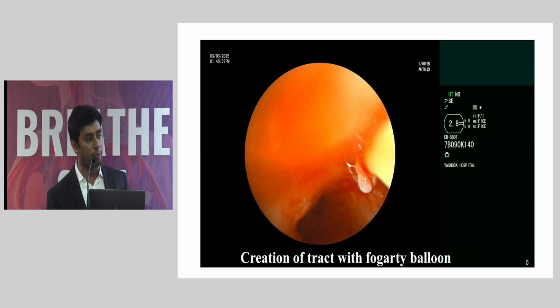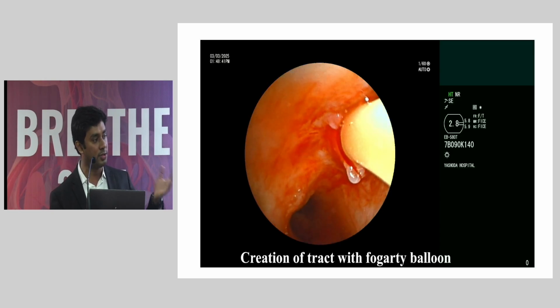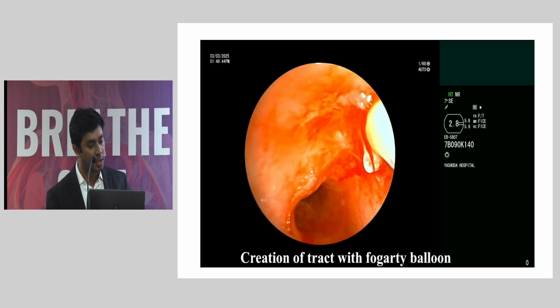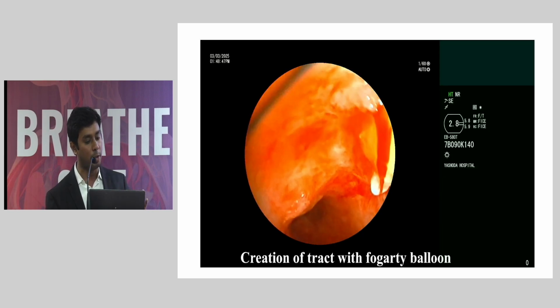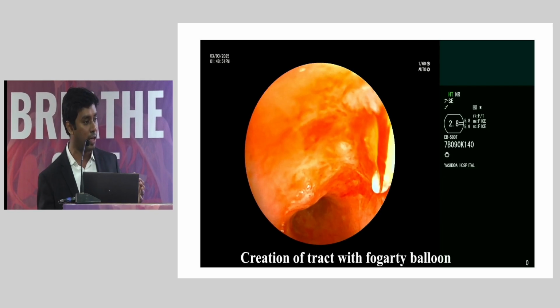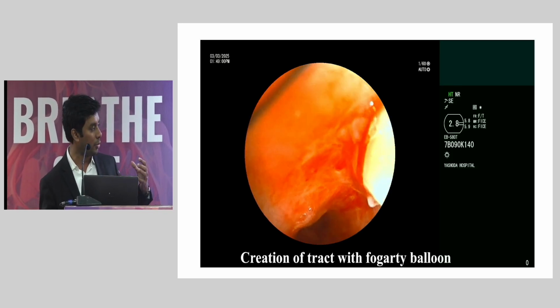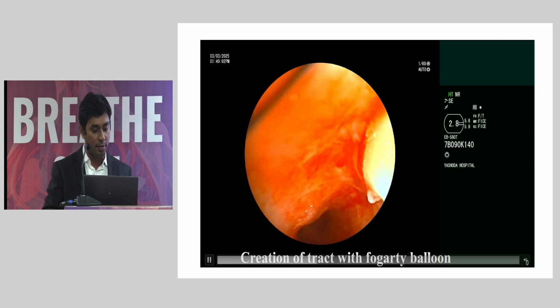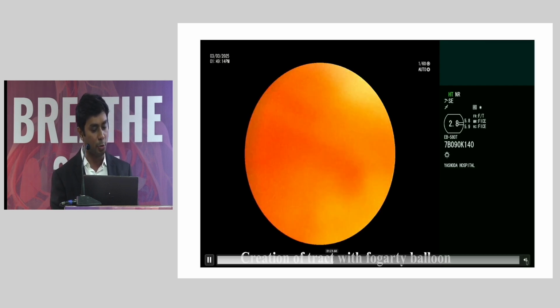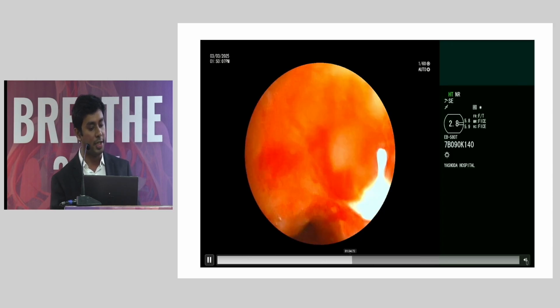So what we are doing in this case is trying to open up the right upper lobe, because we know that the distal lung is viable, as there is a certain amount of aeration in the distal lung. Initially we are passing the Fogarty balloon to open up this airway. And now you will see that as we open up the airway, the pus contained in the distal airway starts coming out. We are using this Fogarty balloon. These are technically challenging cases because they take a lot of time. What we are showing is a 2 or 3 minute video, but generally it takes hours in the OT.